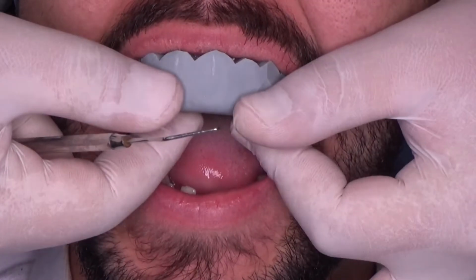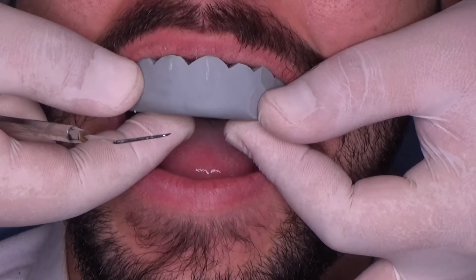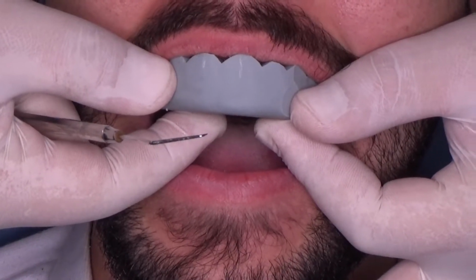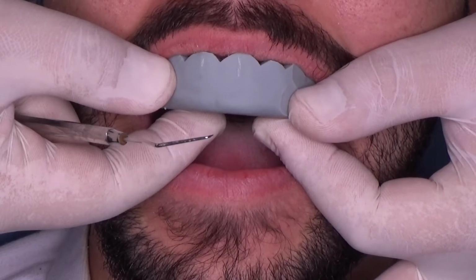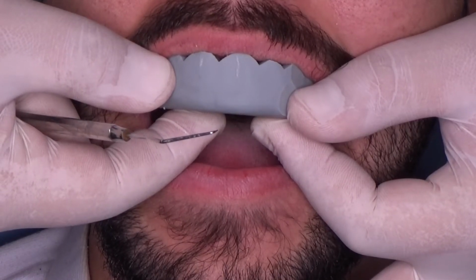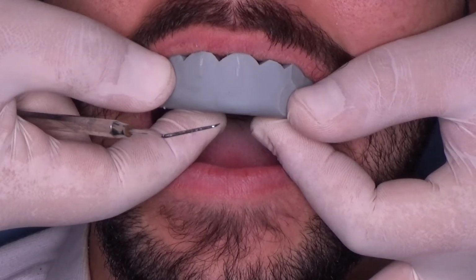So this mock-up, you will use it to prepare. If it's a veneers case, you will prepare through the mock-up because it's an additive case, no? Yes, this is completely an additive case, so we can prep through the mock-up. Okay. So in this case, we had to add some composite on the incisal edge. What if we have to remove from the central?